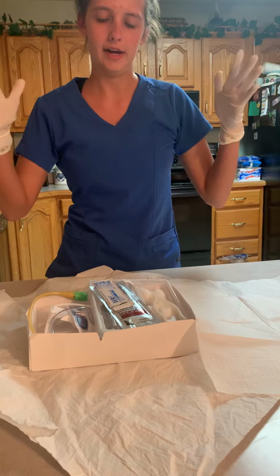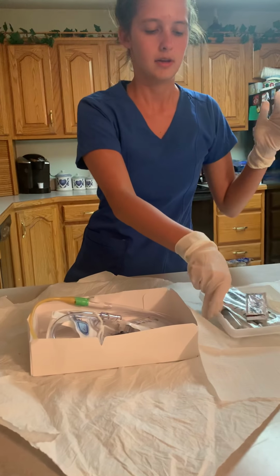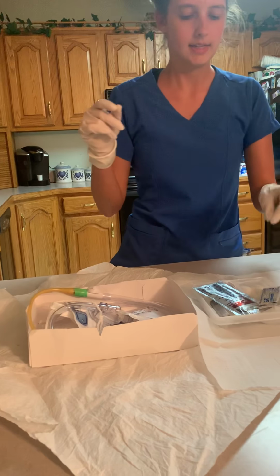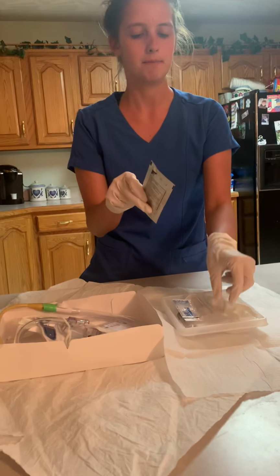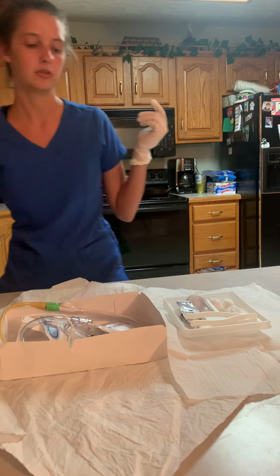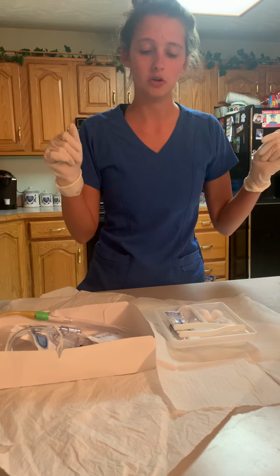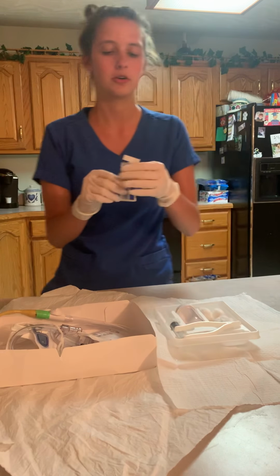Okay, and now I'm going to get my tray out and get that situated. Okay, and first I'm going to put the betadine onto the cotton balls, and then we're going to go out and away from the sterile field. And then while I have two sterile hands, I am going to go ahead and lubricate my catheter tube.